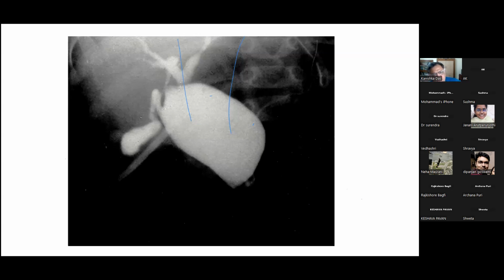So this was a patient, obviously, in whom they have put a T-tube. What are the situations where you might want to put a T-tube like this? When there is cholangitis and to buy time, previously they used to keep a tube, and you can't do a PTBD, etc. Another situation is intraoperatively they have realized that it is a bad thing and they can't go ahead with the definitive surgery and they have put a T-tube. It's a very unusual situation.